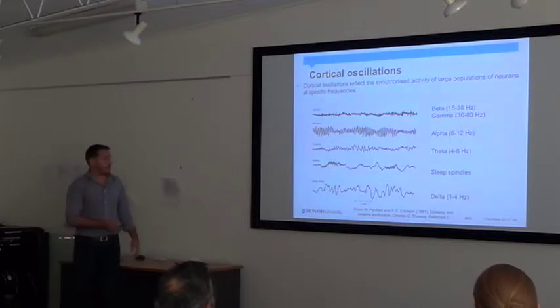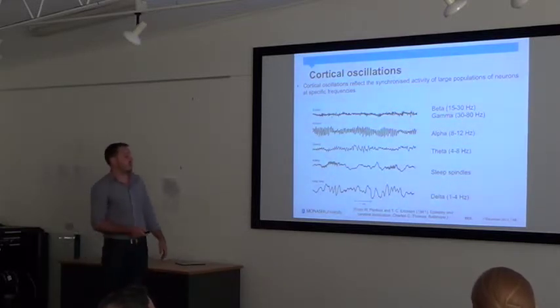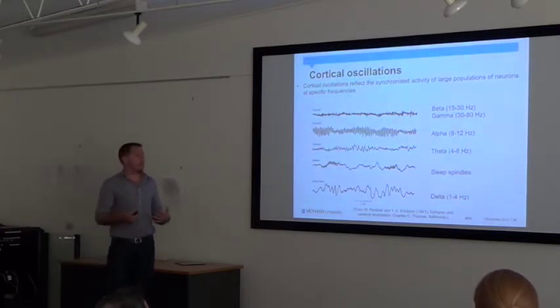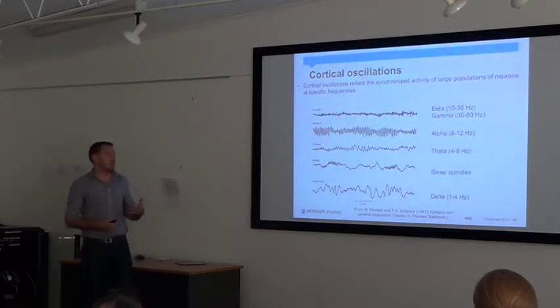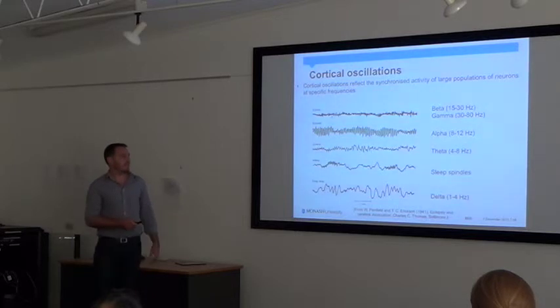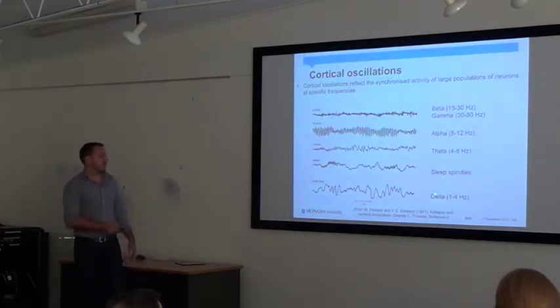So as I mentioned, cortical oscillations, they've been around for a very long time. There's just some recordings from back in the 1940s. But what generally has happened over time is that it's been noticed that different oscillation frequencies generally happen during different tasks, essentially. So some very basic taxonomy from very early on. We get these lower frequency delta waves that often happen during sleep.